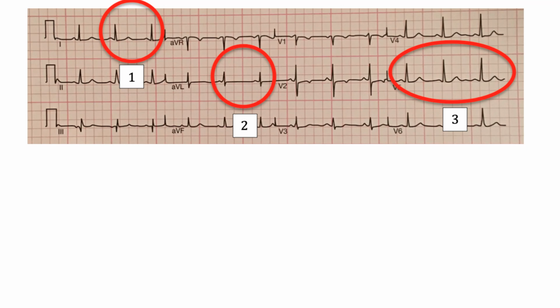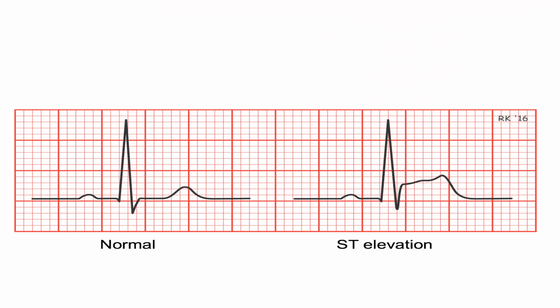In this site, there is also abnormal size of the ECG. Abnormal shape of ECG, the size of the QRS complex is abnormal. This is also a picture for normal ECG, and another abnormal beat in which the ST segment is elevated.